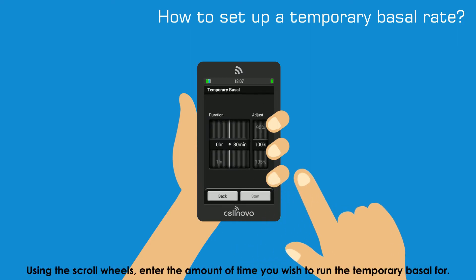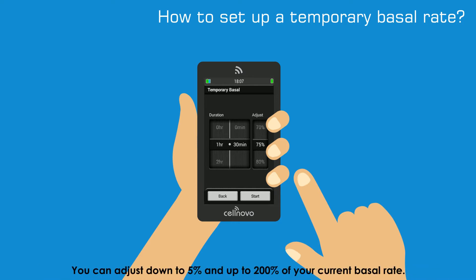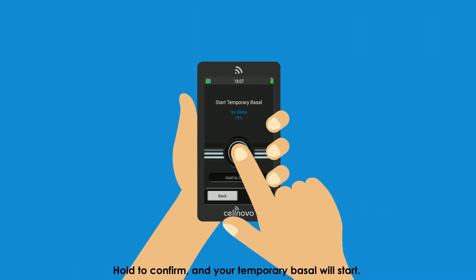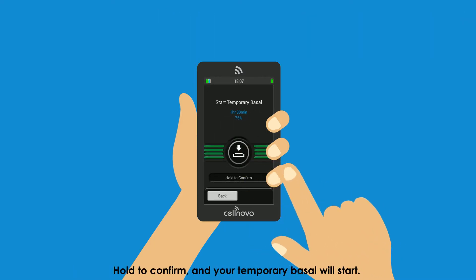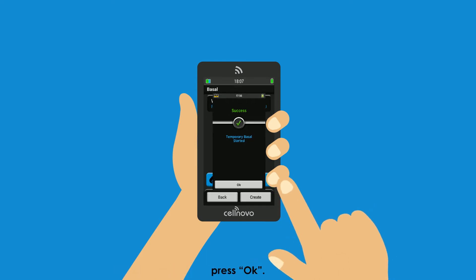Using the scroll wheels, enter the amount of time you wish to run the temporary Basal for. You can adjust down to 5% and up to 200% of your current Basal rate. Hold to confirm and your temporary Basal will start. Press OK.